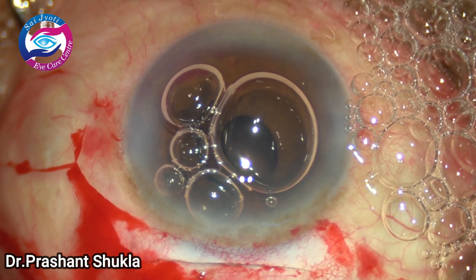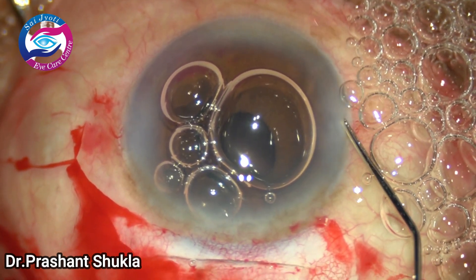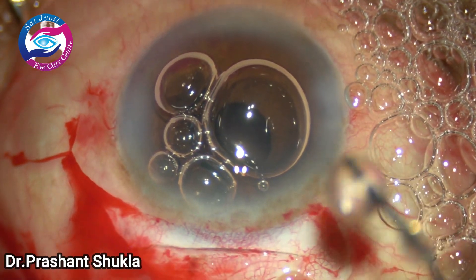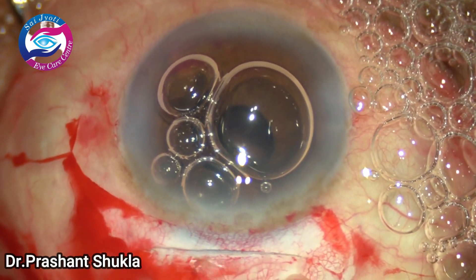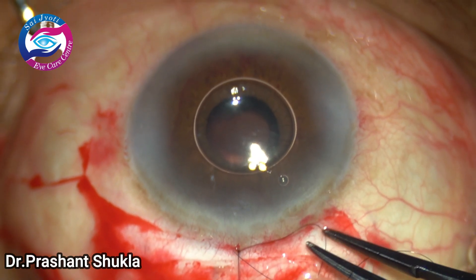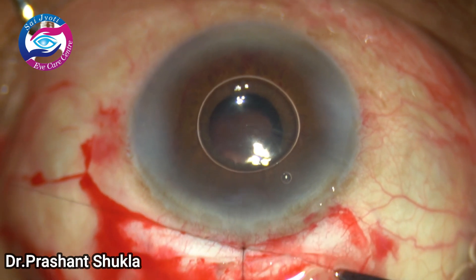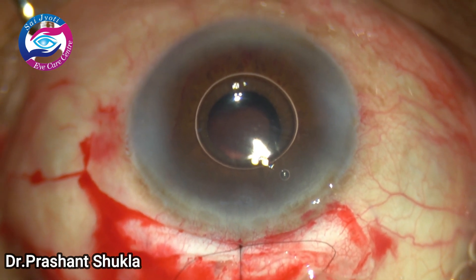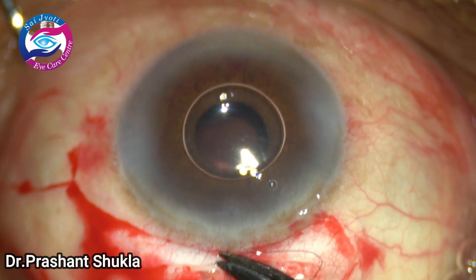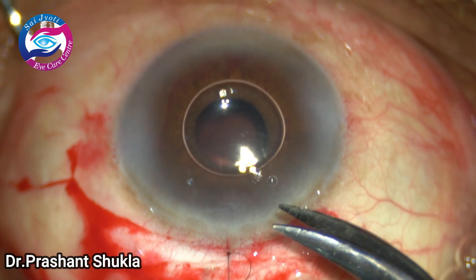I am going to put one 10-0 nylon suture to counteract the against-the-rule astigmatism which would have been caused by this straight long incision. The suture has been placed and the ends will be cut in a moment. The conjunctiva would then be closed with cautery. Hope you liked the video and I hope it's going to help you in your learning career.